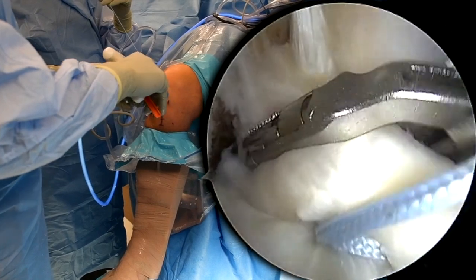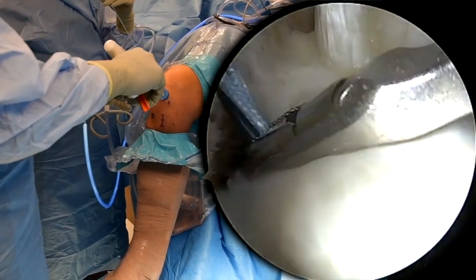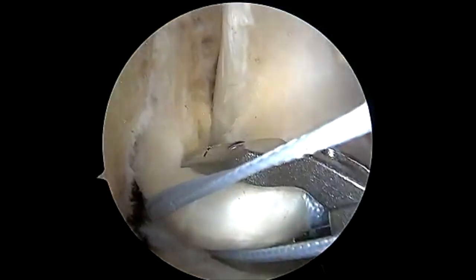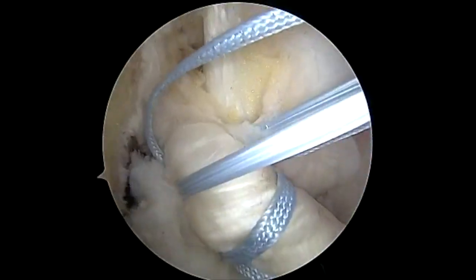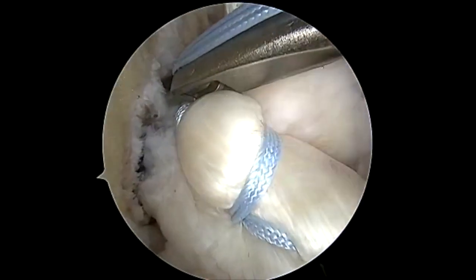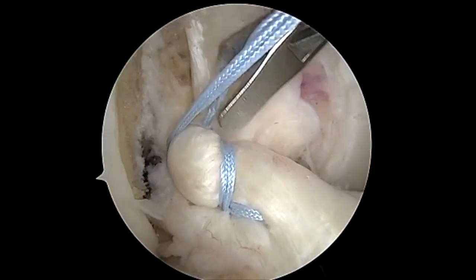Three to 4 passes through a PassPort button cannula in the anteromedial portal can usually be made before the final pass exits the proximal end towards the femur. Next, tension of the ACL and the footprint is checked by pulling the threads with the suture retriever. Tape sutures are then retrieved through the accessory portal.